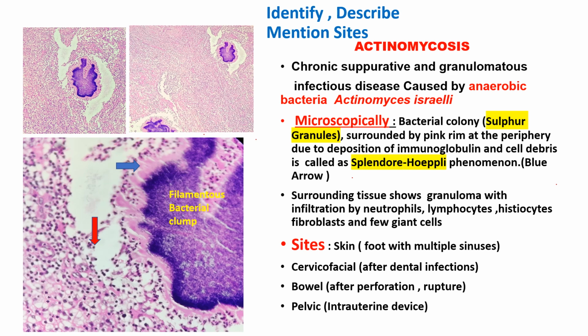What are the sites for actinomyces? The foot, sole of the foot. There are museum specimens in most of the medical colleges showing sinuses and edematous foot. This is actinomyces. Cervicofacial actinomycosis may be there after a dental infection or extraction.